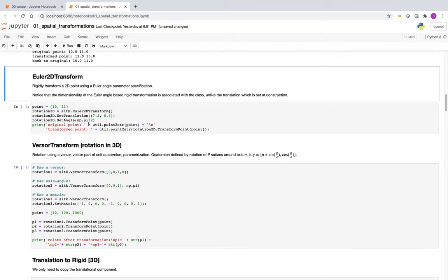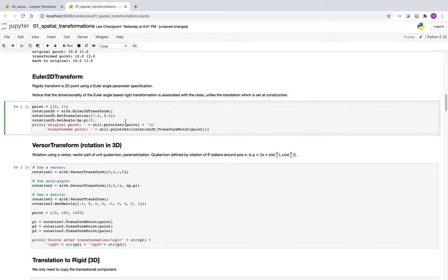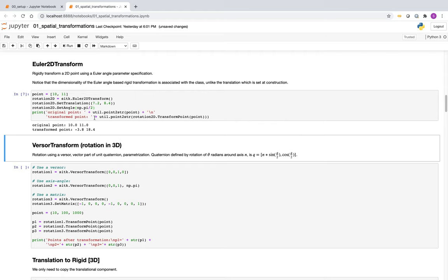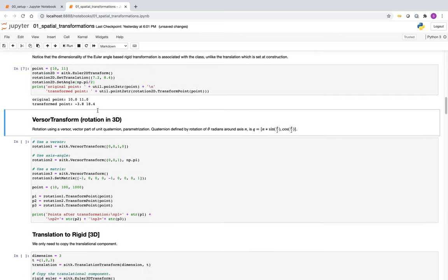Now let's look at the Euler 2D transform, parameterized by a single angle given in radians. We can set the translation and set the angle, then apply the transform. If you do the computations manually, you'll see that you get the expected results.